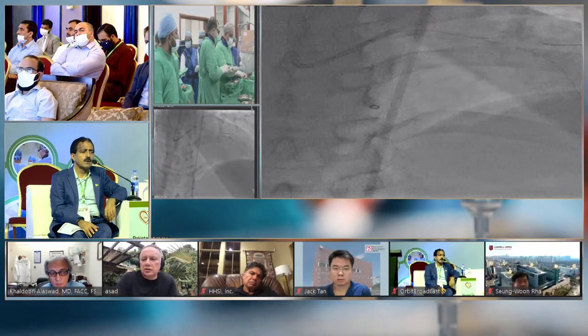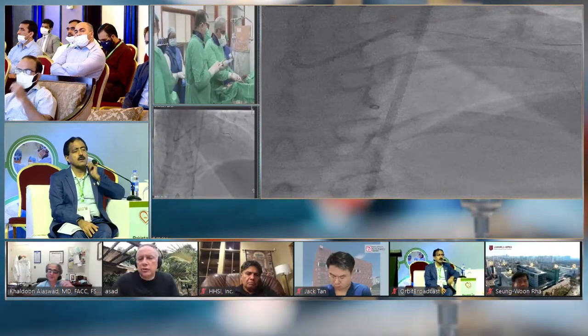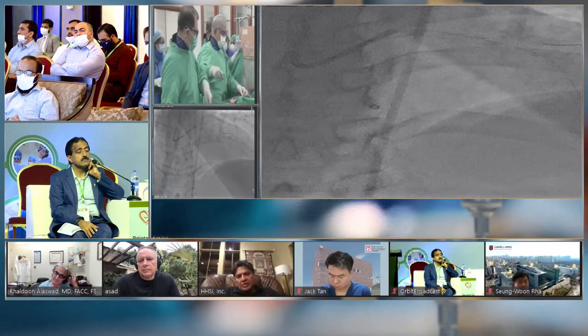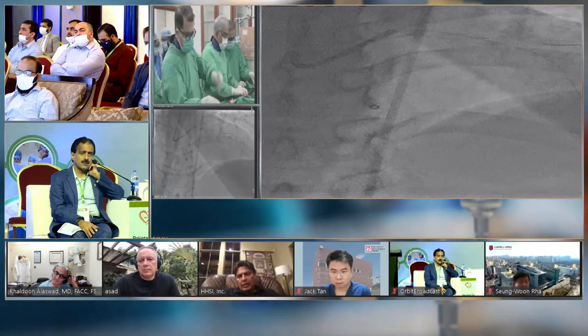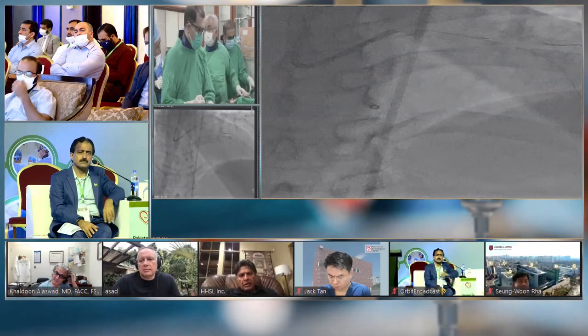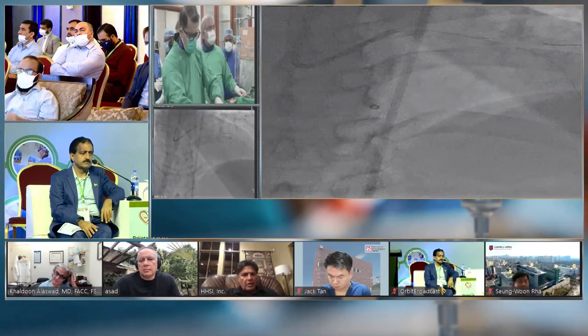Thank you. Dr. Tahir Ali, how would you do it in your lab? So this is an excellent job. The only thing I would say is that the proximal cap is fairly obvious.